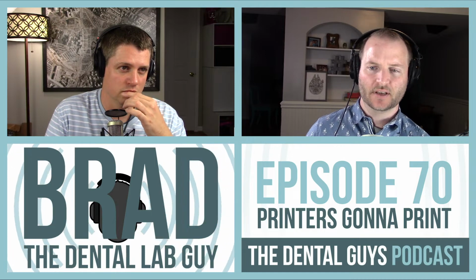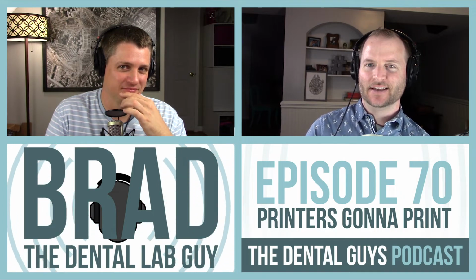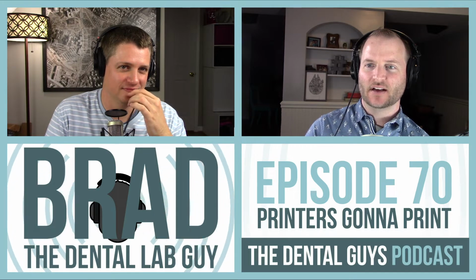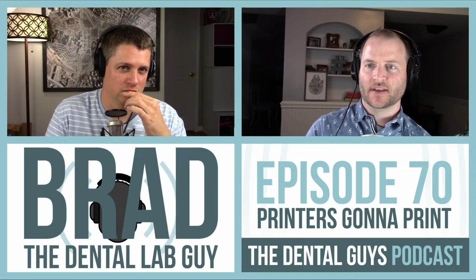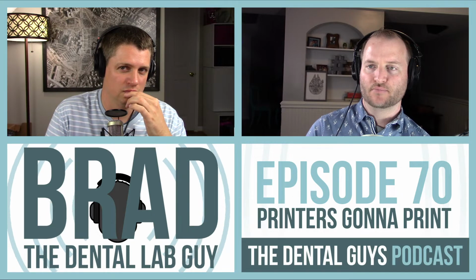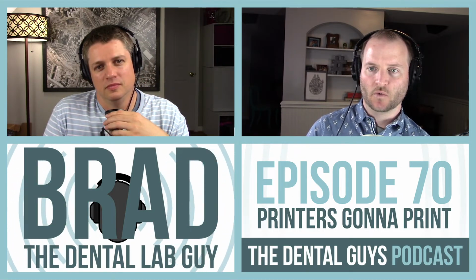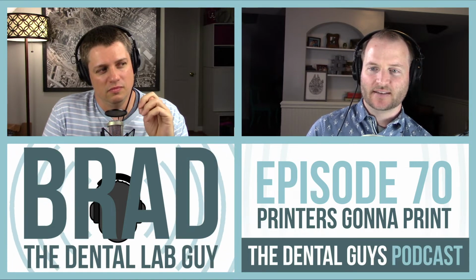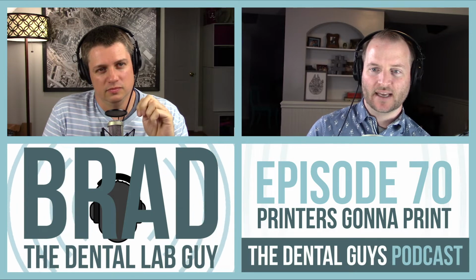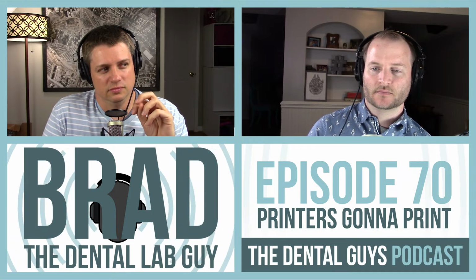Wow, so that's actually a pretty big deal, because what you're saying is it's predictable, but it's actually kind of hard to make it predictable. It sounds like you can't just make the blanket statement that 3D printed models are predictable for crown margins. It's something that you really have to work at, and you have to have the right technology and all of that. So you can't make a blanket statement, because you've got labs out there who are saying, I don't have a model that works. Right. Yep, exactly. And their expectations.